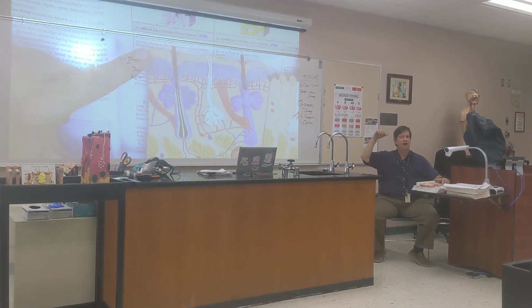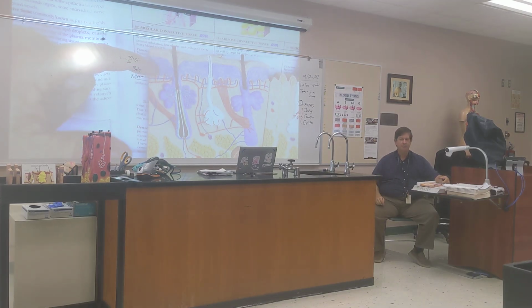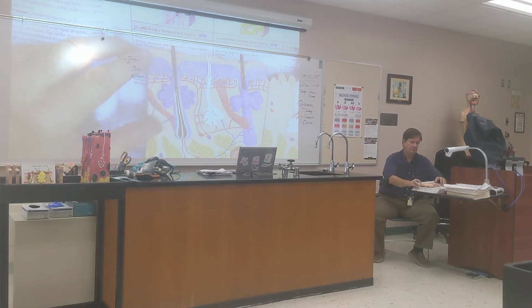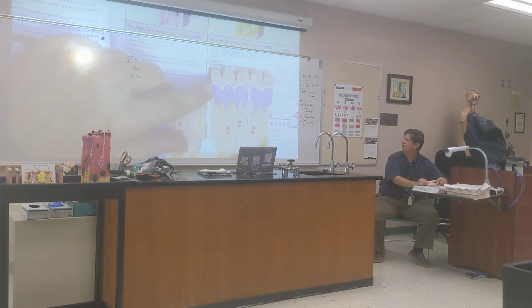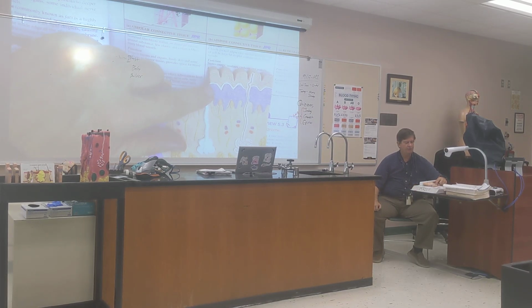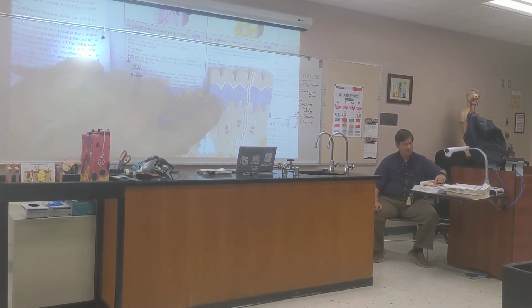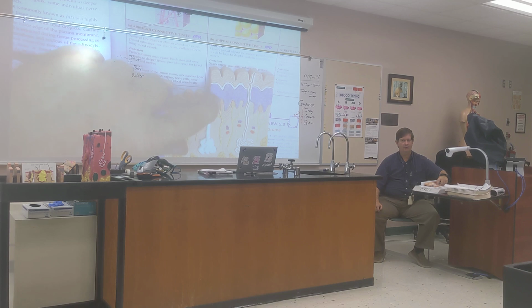The stratum corneum is the one on the outside, in pink. Below that, in purple, because it's thick skin, is the stratum lucidum, which is only found in thick skin. Then we have granulosum, spinosum, and at the very base of the epithelium, the stratum basale. So those are the layers.